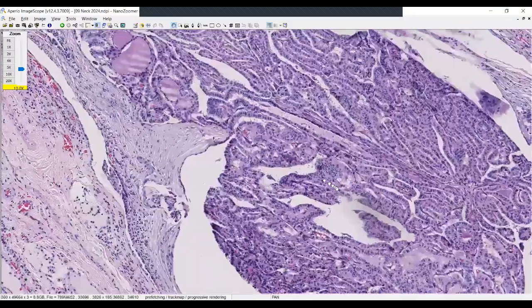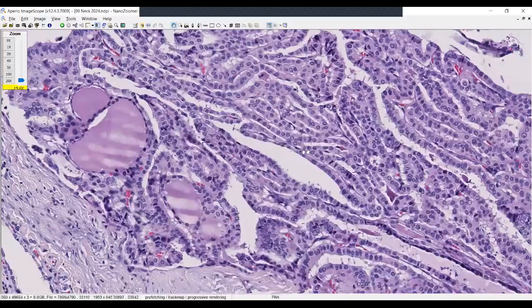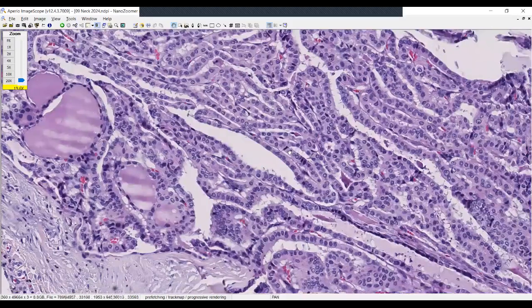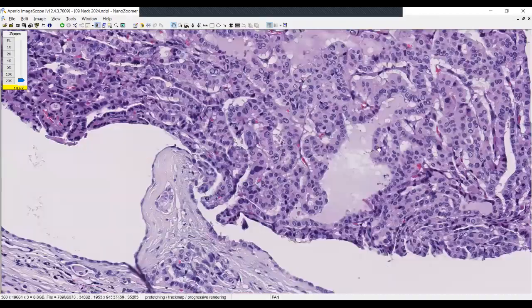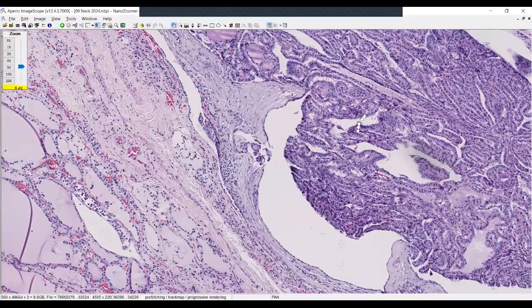If I look at this lesion, I think you can tell that, first of all, this is a lymphatic channel, and here is tumor present within that particular lymphatic channel. When I look at high power here, there is certainly colloid production by the tumor. There's remarkable variation in nuclear size and shape. There is stratification, there is overlapping. So this is clearly a wonderful example of, at least microscopic, papillary thyroid carcinoma with capsular invasion and also showing lymphatic invasion over here.